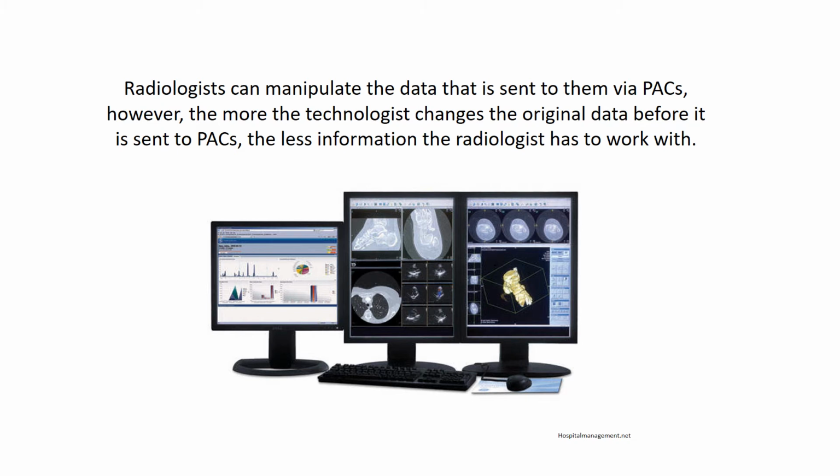So many departments, if you've set the correct technical factors and chosen the correct anatomical part so that the correct histogram analysis can be done and the correct lookup table was utilized, don't like you to change or manipulate the image very much. Because as the radiographer, student radiographer, or the technologist you're with starts manipulating a lot and then sends it over in PACS, the radiologist has less information that he or she can utilize.